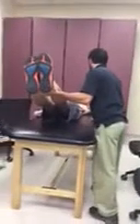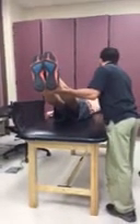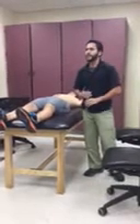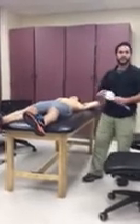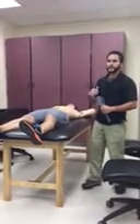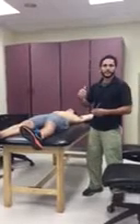Stationary is going to be in line with the thoracic spine. Movable is going to be in line with the lateral side of the femur. All right, you can relax. And I got about 30 degrees, and that right there is a 4+. And 0 to 15, 0 to 14 is a 5. 15 to 30 is a 4+, and then every 15 degrees thereafter is a minus. Okay.